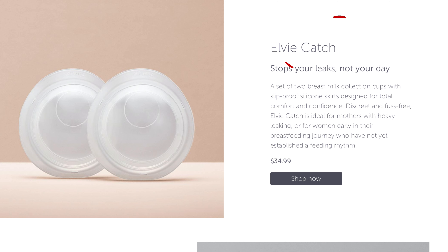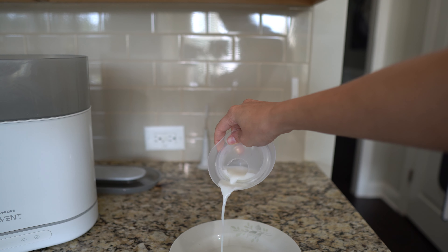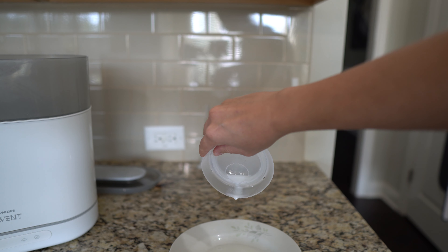The Elvie Catch, as you can tell from the name, is meant to catch milk. It's meant to be put into your bra instead of putting a pad, and actually take that milk and use it for your baby. Whereas the Medela Soft Shell was designed for injured nipples, and that is why the Medela Soft Shell has holes at the top — when your nipples are injured, you want to make sure that they breathe.